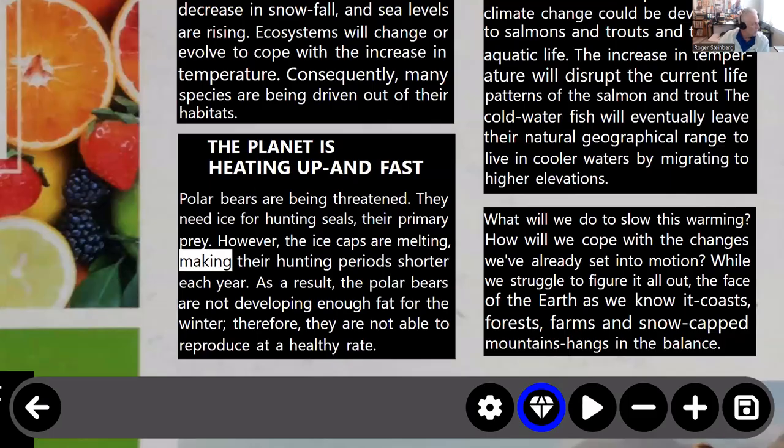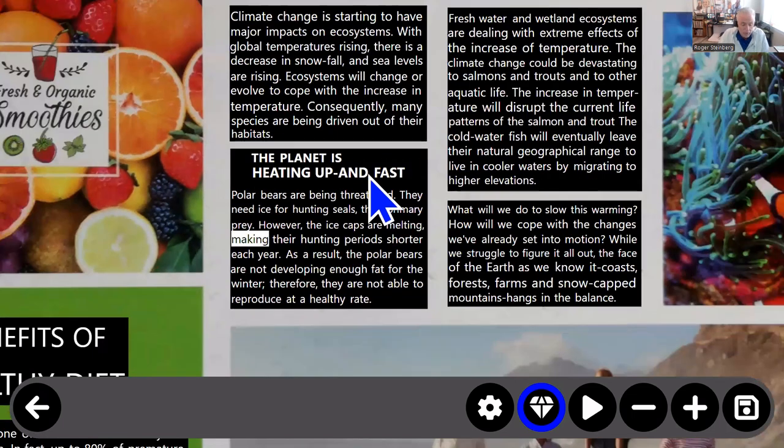I see a question from Kyle. When using on-screen annotations, will it be digital ink when I use a pen on a smart panel? Great question. If I had a smart panel to test on, I could not say for sure. I do know that we have annotations ourselves on the roadmap within Prodigi.